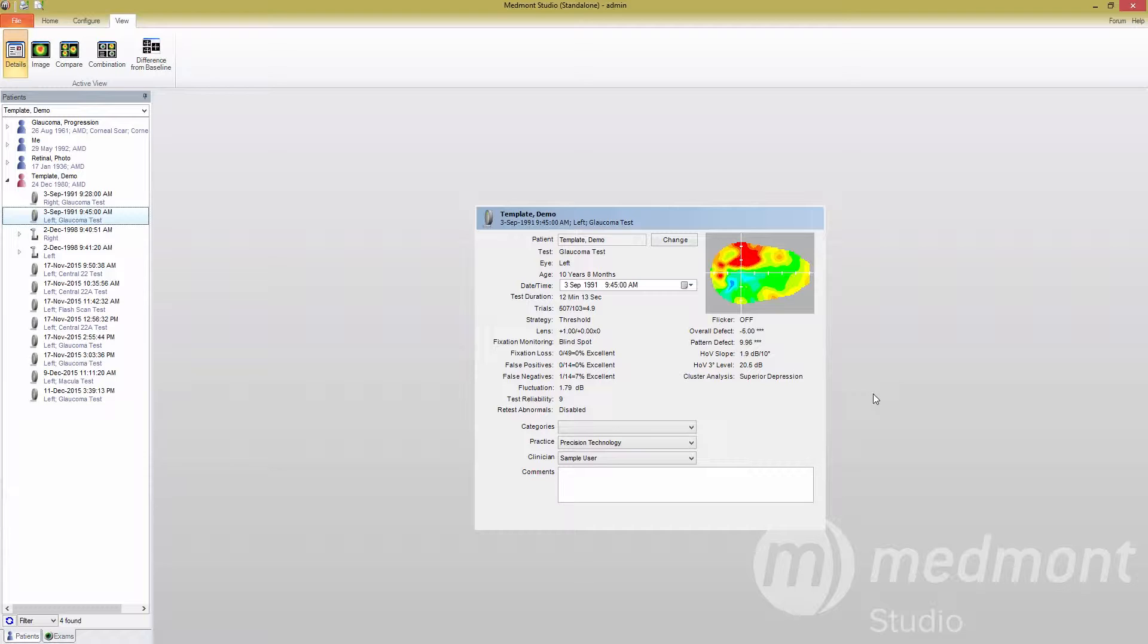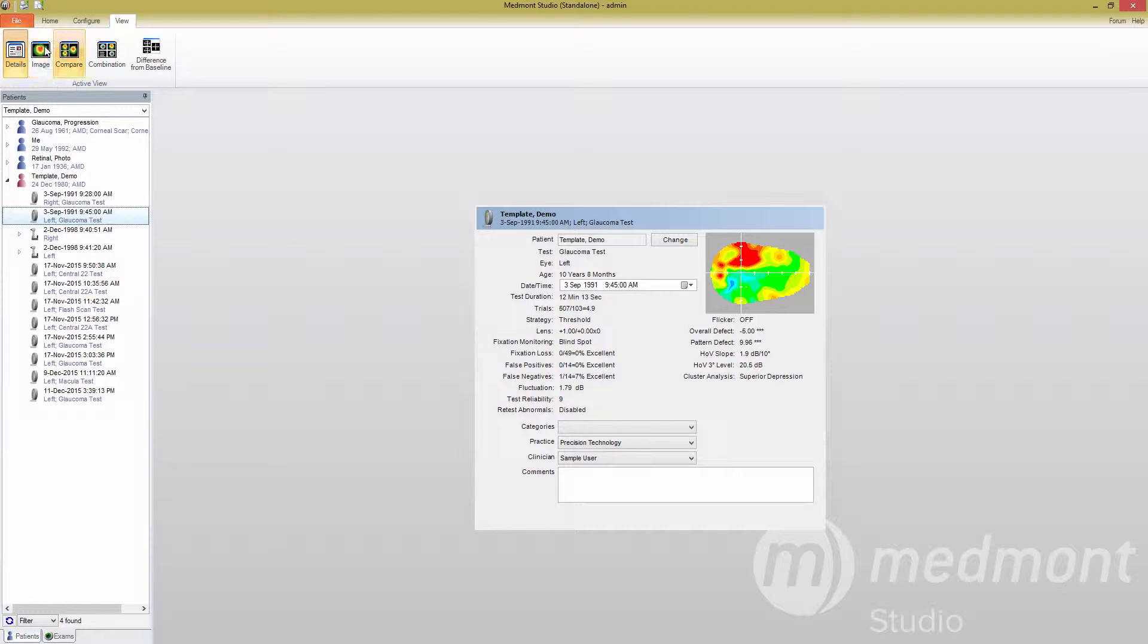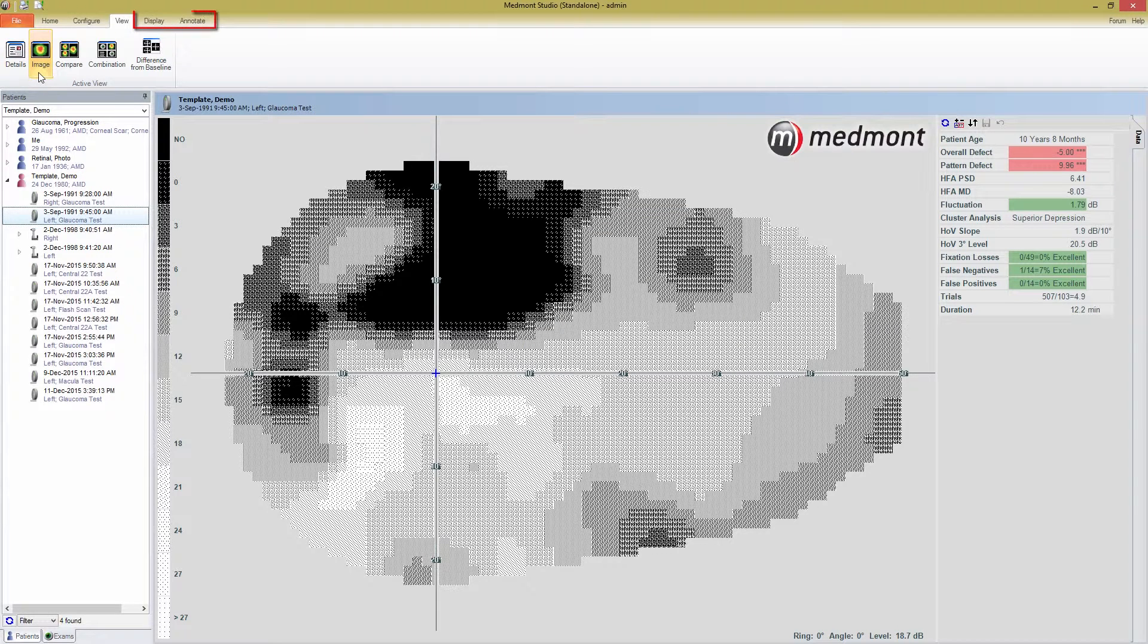When you're ready to look at the test result in more detail, press the Image button. Notice before you press it that the tabs available to you depend on the view you're in. Once I press Image View, the Display and Annotate tabs appear.